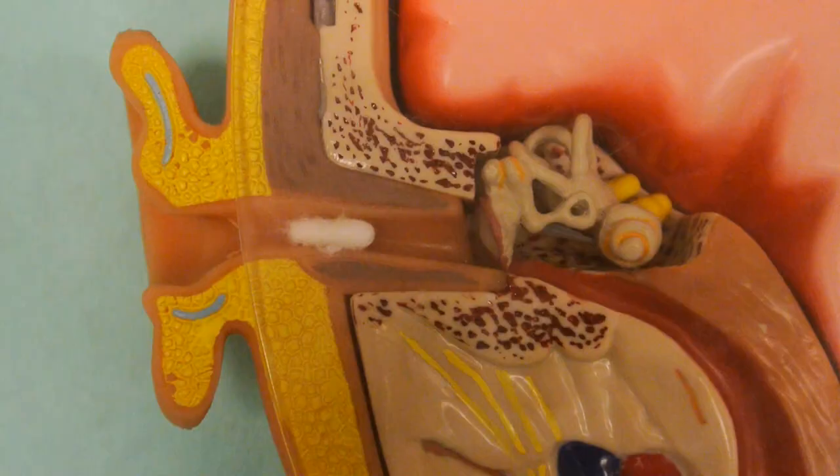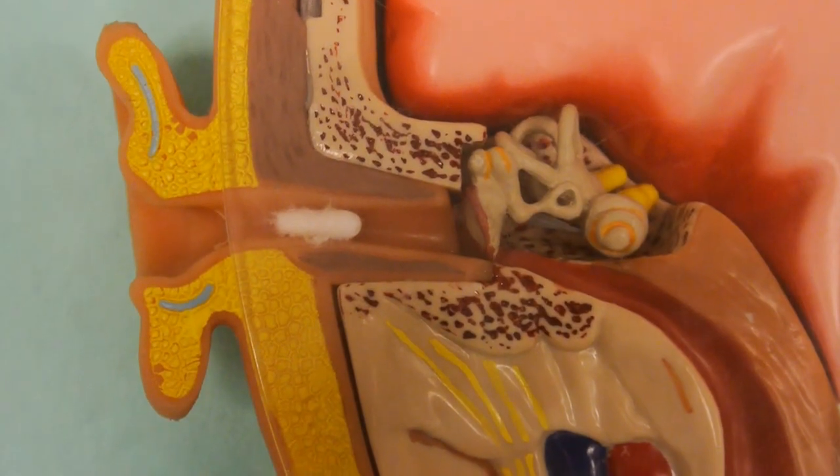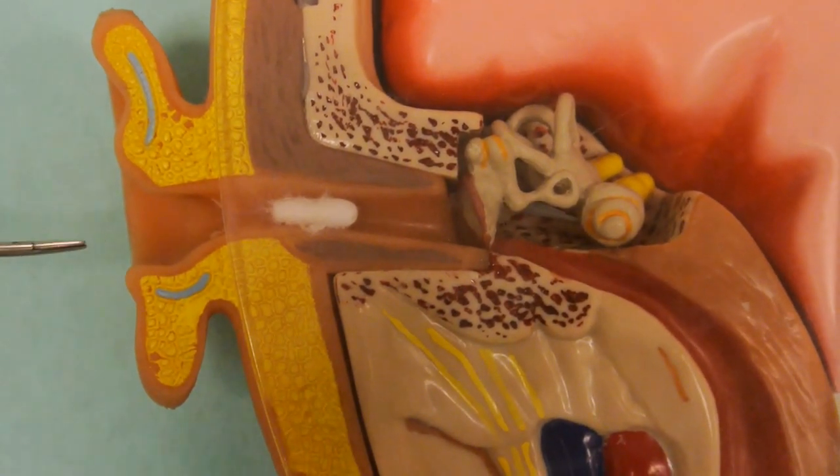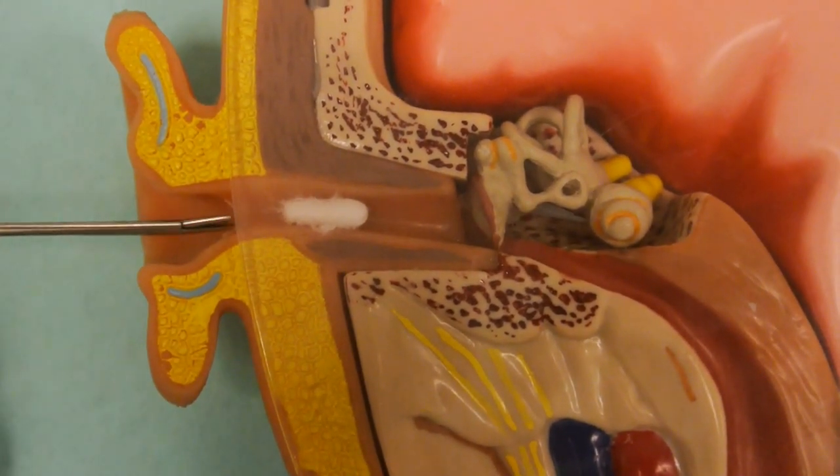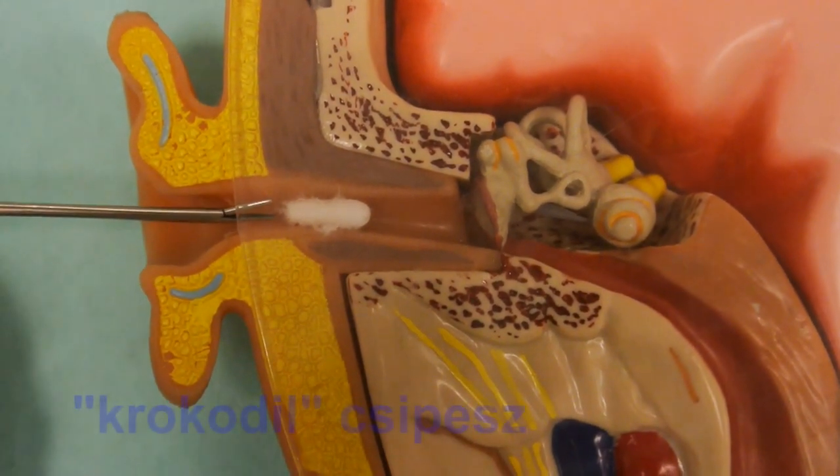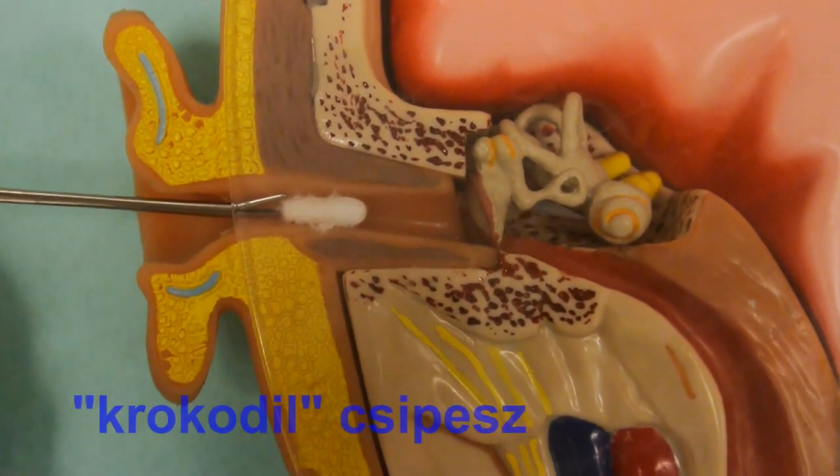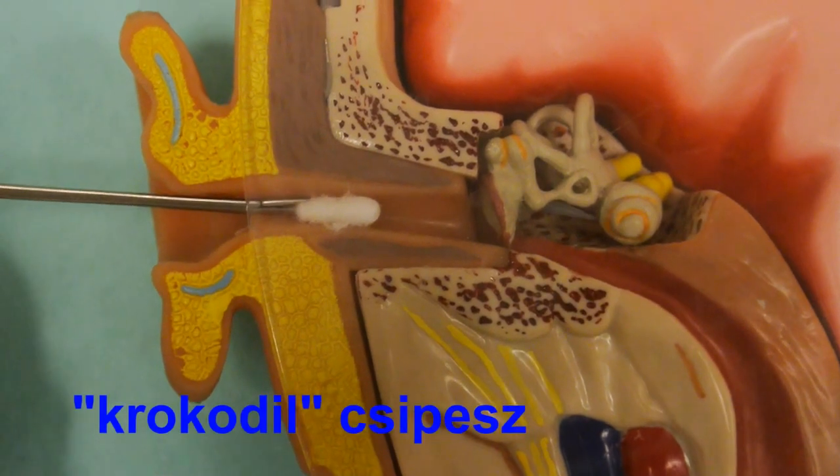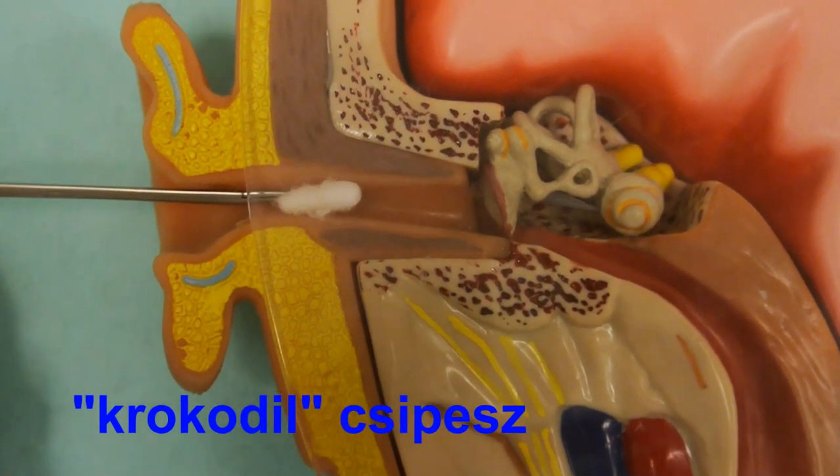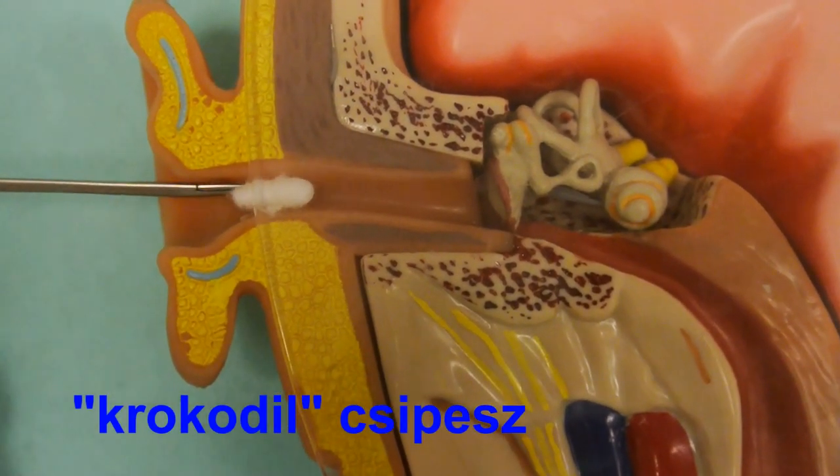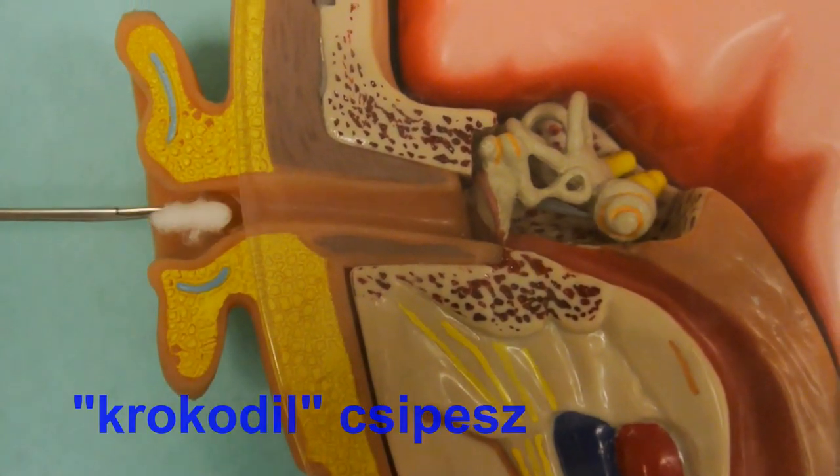We can use different sized and shaped ear forceps, such as crocodile forceps, to remove foreign bodies which can be well grabbed.